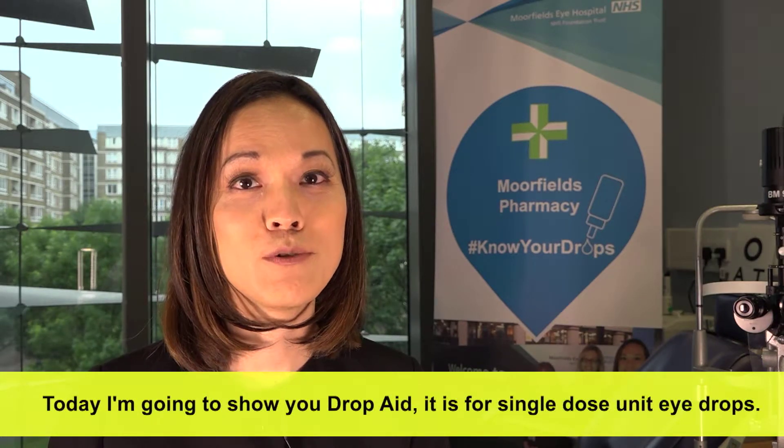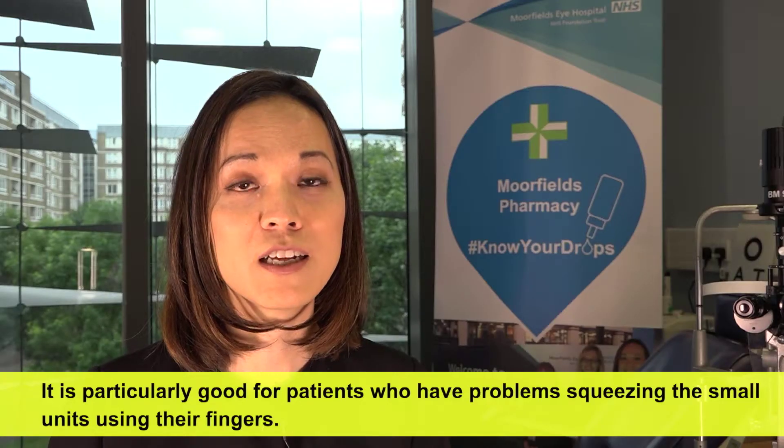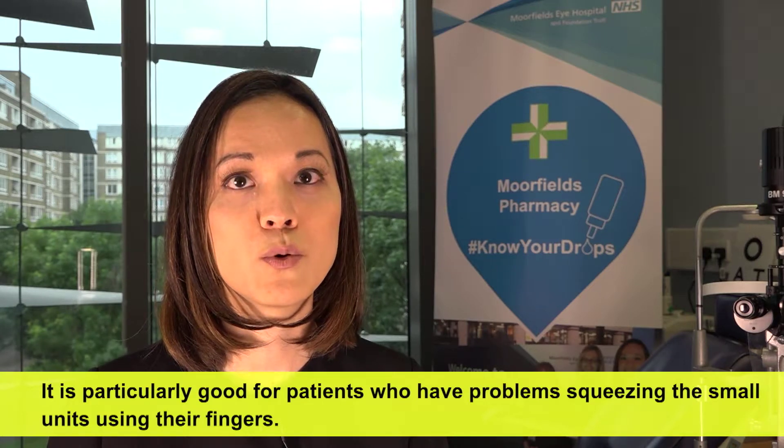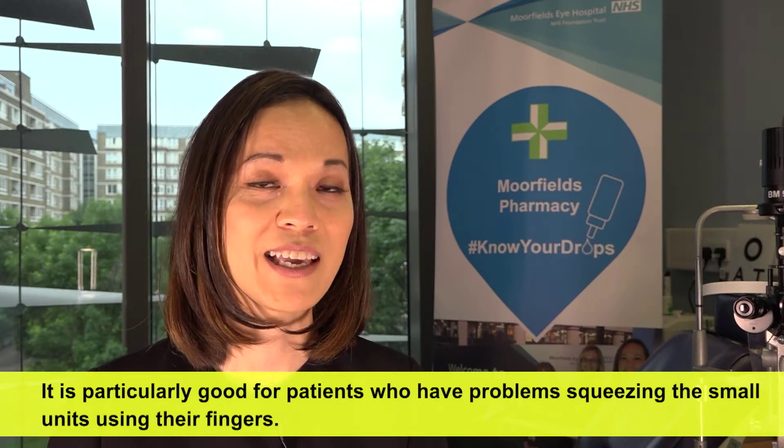Today, I'm going to show you DropAid. It is for single dose unit eye drops. It is particularly good for patients who have problems squeezing the small units using their fingers.